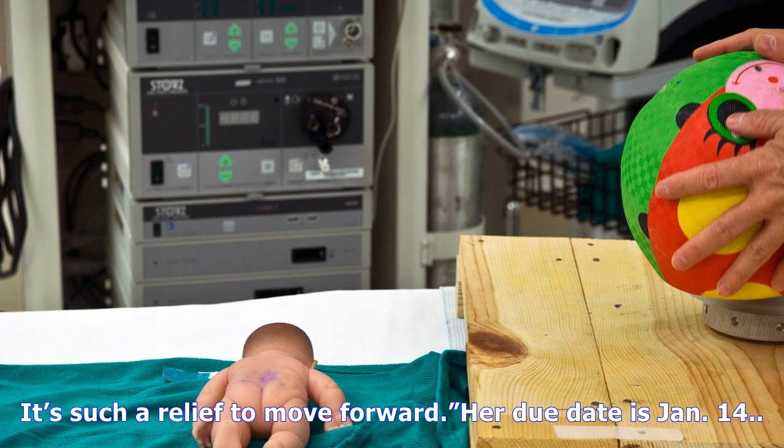Surgeons at Johns Hopkins have used it to treat 5 patients, and Dr. Belfort is helping to train colleagues at Stanford. Doctors who practice the open procedure are critical, and warn that the carbon dioxide pumped into the uterus may harm the fetus and cause neurological problems. Dr. Belfort said there has been no evidence of harm, but time will tell.